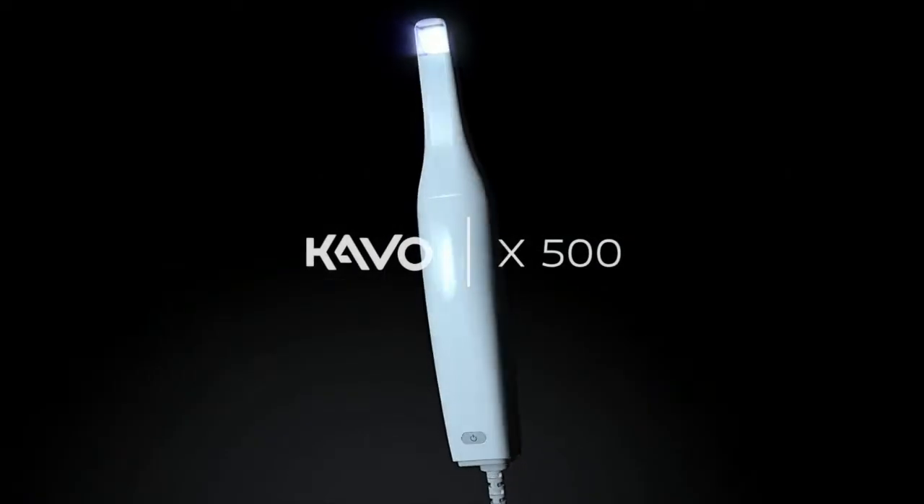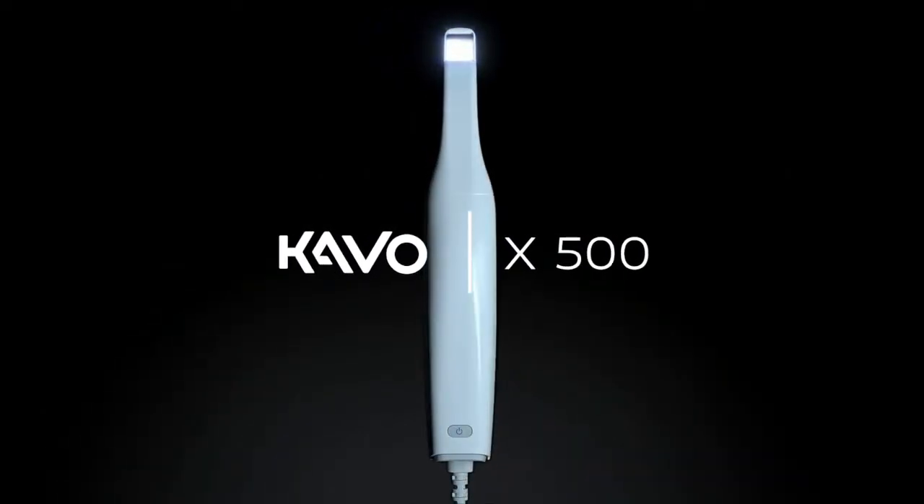Together with the rest of our imaging portfolio, the KaVo X500 kickstarts your digital transformation.